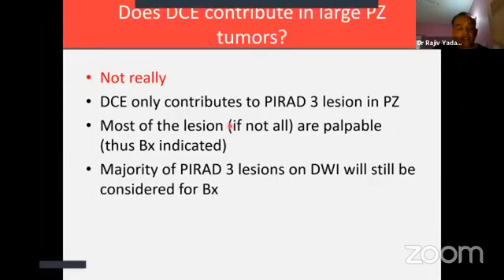So if we can shorten the sequence time, it is not only comfortable for the patient, because most of the patients who undergo MRI will discuss being claustrophobic. The more time they spend in that tunnel, the more scared they are. So imagine if you want to repeat the MRI again and again, say a patient on surveillance. Their first experience will decide whether they will go for a second MRI or not. So try to shorten this MRI. It's not only shortening the duration of the MRI, but also spending less money.